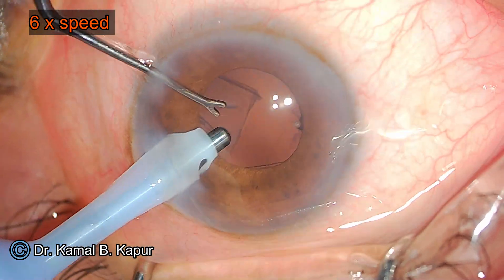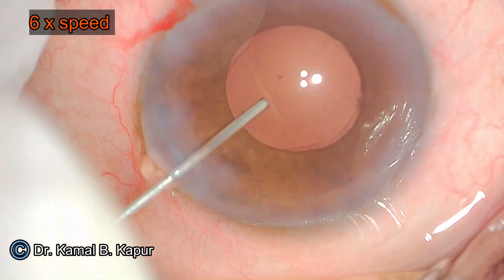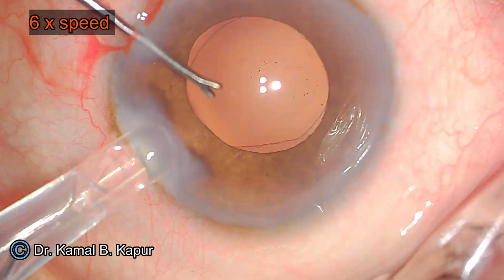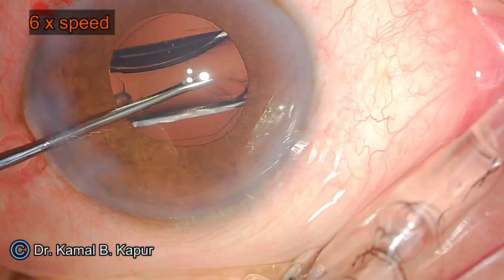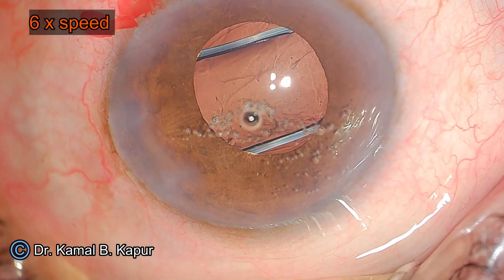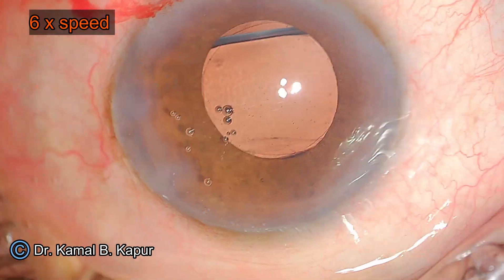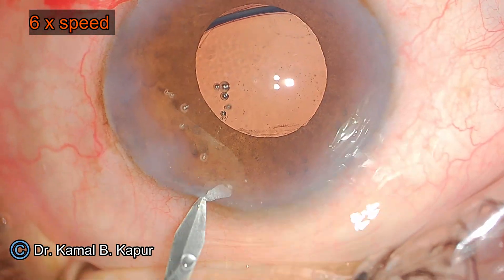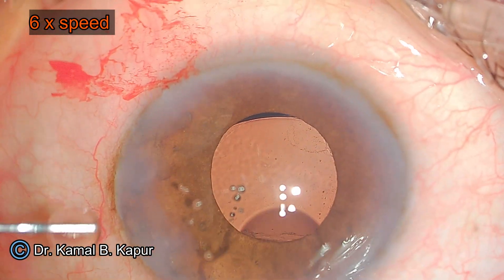Once the cataract has been removed, we ensure that we implant the IOL. After IOL implantation, we use cohesive viscoelastic. It is always recommended to use cohesive viscoelastic while performing the eye stent by Glaukos because it gives stability to the chamber, does not leak, and also provides very good visualization of the angle and the trabecular meshwork.